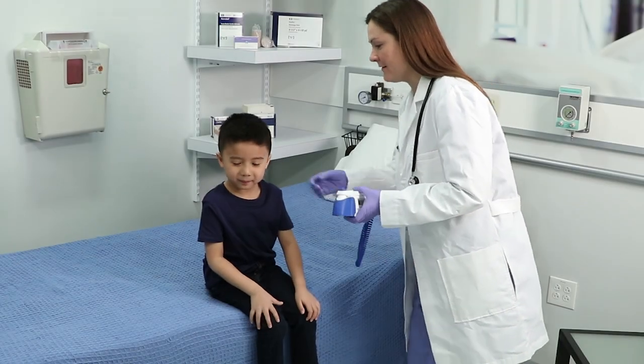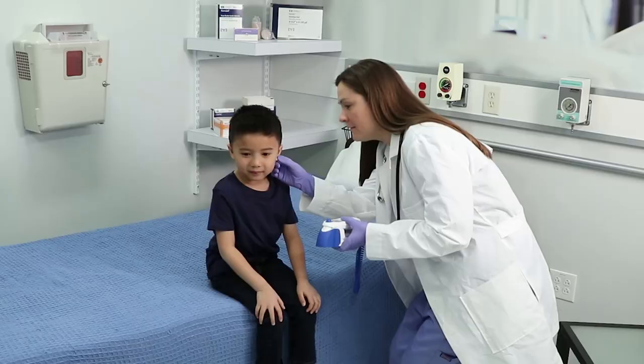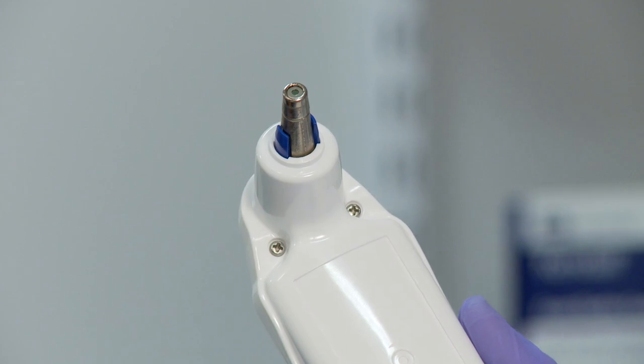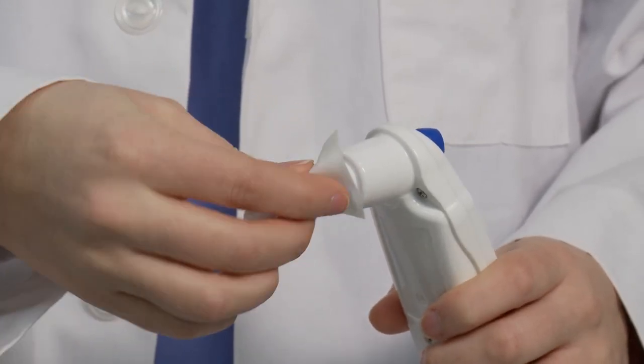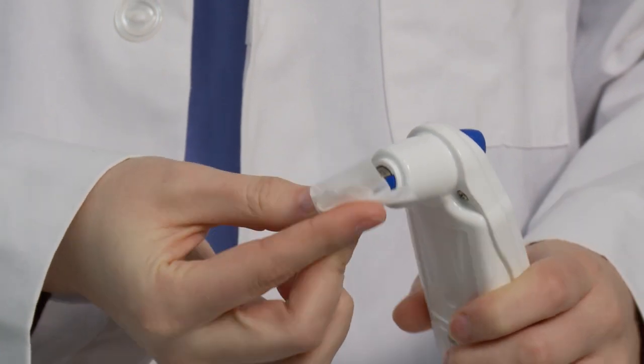The following section will cover taking a temperature with the Genius 3 tympanic thermometer. Begin by visually inspecting the patient's ear canal. Next, inspect the probe lens to ensure the tip is clean and clear of debris. If debris is present, clean the probe tip per directions in the user manual or by accessing the clean video.